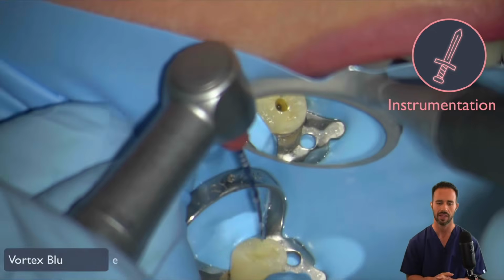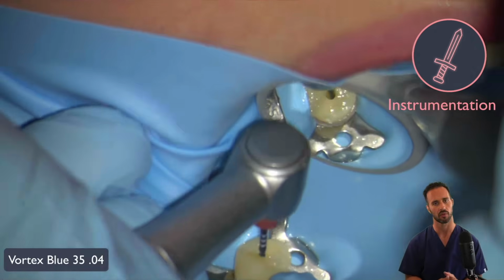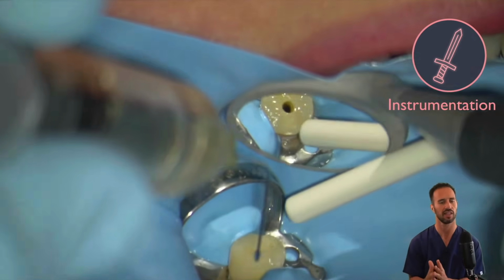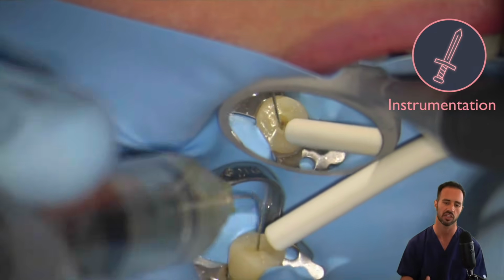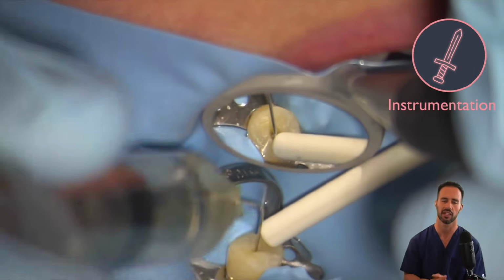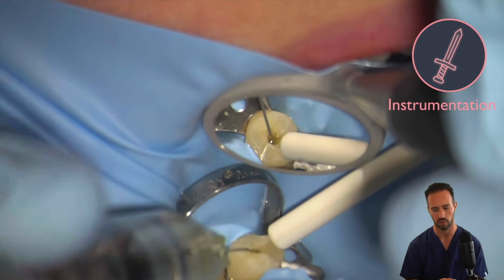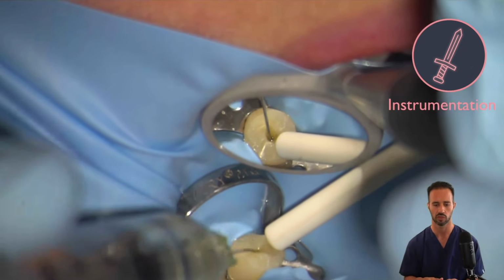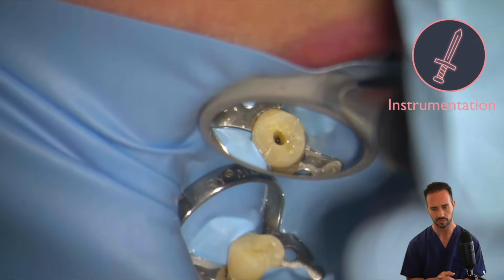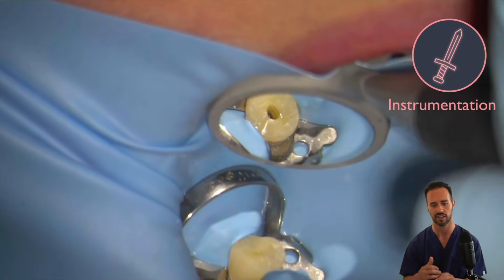Okay? And now we got our size 35 Vortex Blue 04 taper rotary file. That's very good. And you can see it's starting to look like a final shape internally. You'll notice that the walls look nice and clean as we get into our bigger rotary files. So lots and lots of sodium hypochlorite here. That's going to, like I said, make all the difference in your disinfection. And you can see that it's nice and clean in there. It's starting to take its final shape.